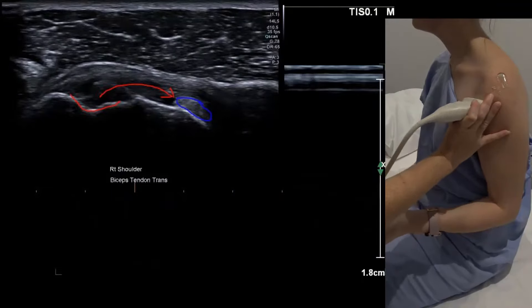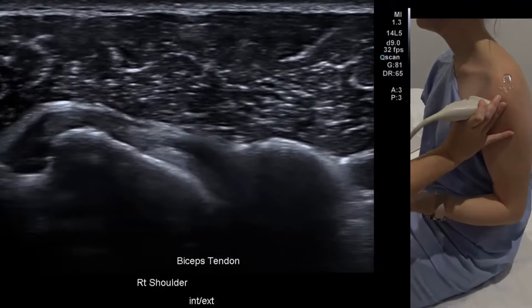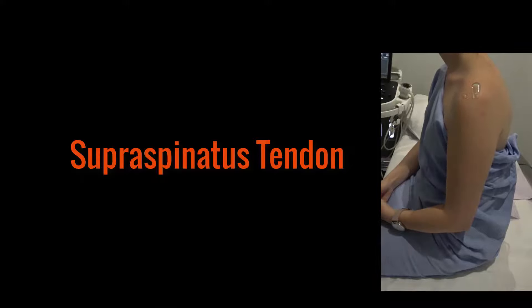You can also check if the biceps is subluxing by doing a little dynamic test. Supraspinatus can be a difficult tendon to approach. The first thing is don't take the arm back to the back pocket — it tends to make the patient internally rotate a little.